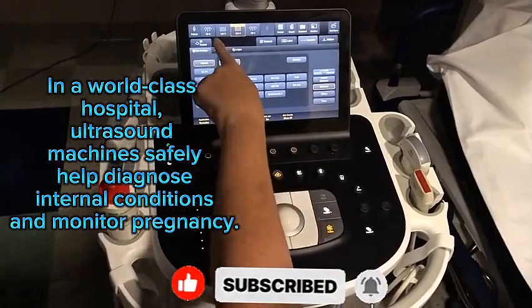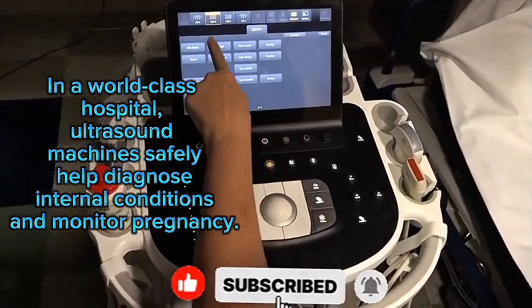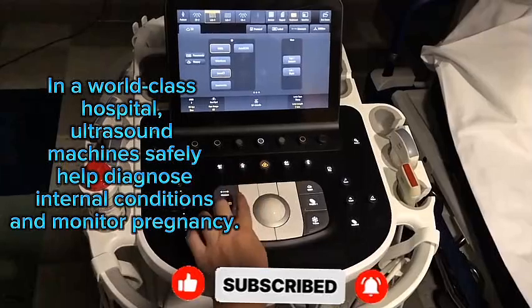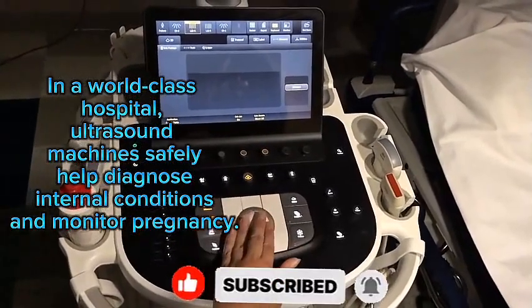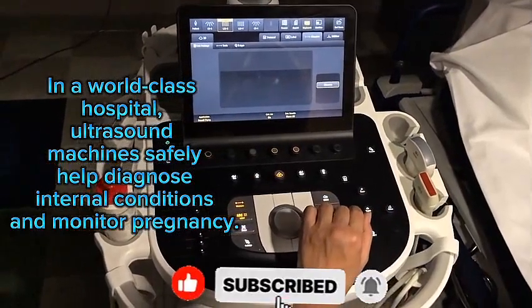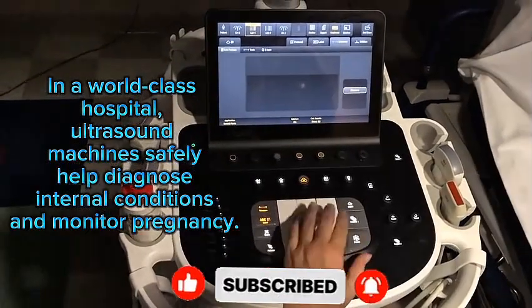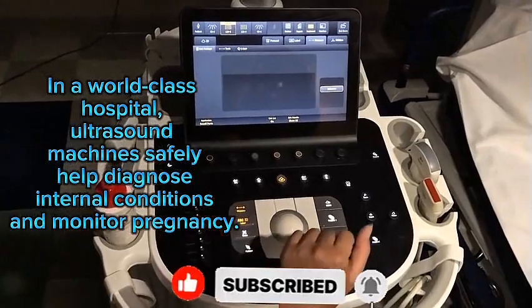Now, depending on what the transducer is set on, when you make a measurement, you can put it into a calc package that will be set up for what you've selected on your transducer, as long as the patient has been selected.